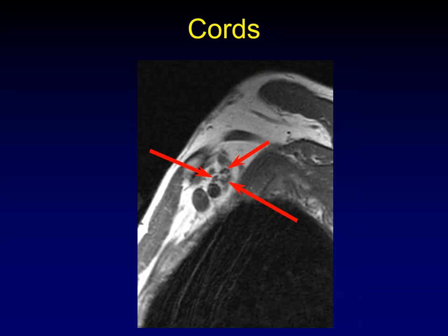Here are the cords. Sometimes it's really hard to make these out as individual structures, but here you can see the posterior, medial, and lateral cords. Sometimes they just look like discrete nerves recombining and twisting around the artery, and that's fine.